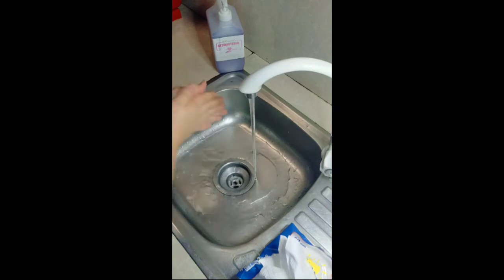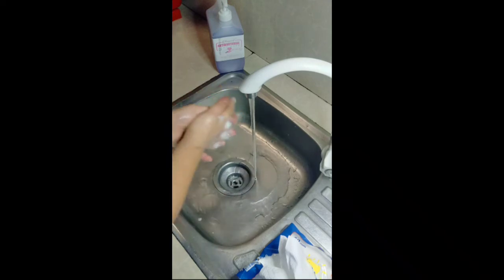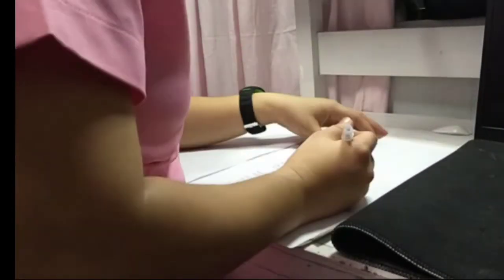Always do proper hand washing before and after the procedure to prevent nosocomial infection. Document all necessary information in the patient's chart and refer to the physician.